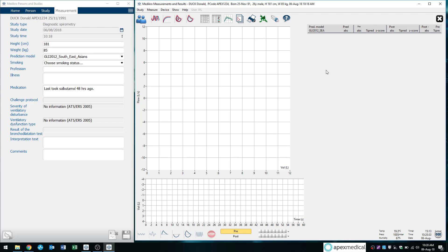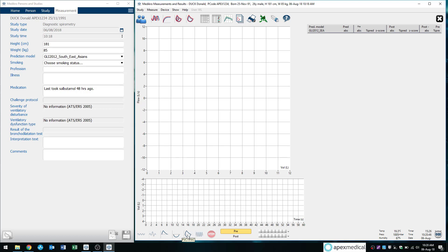So to start testing, we always want to start at the bottom of the screen here. So the button I always recommend my clients to press is this button here, this flow volume loop. It says FVC plus FIVC. So you would click that to start the blow. And then you would click the stop button here to stop the blow.